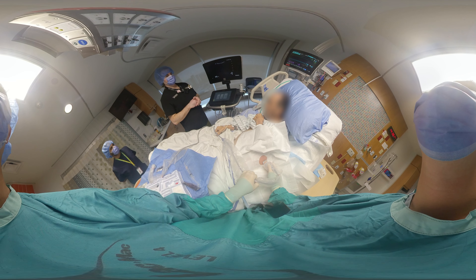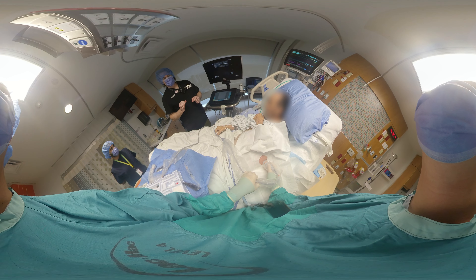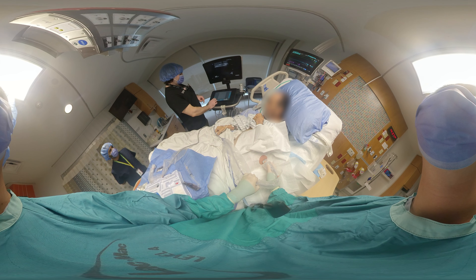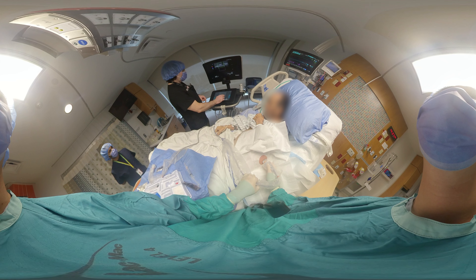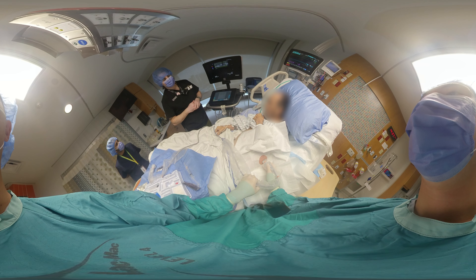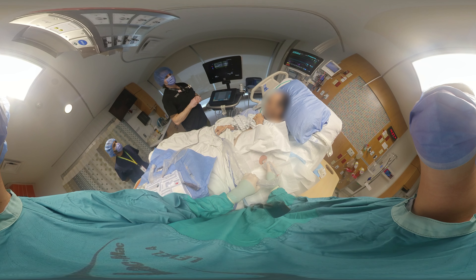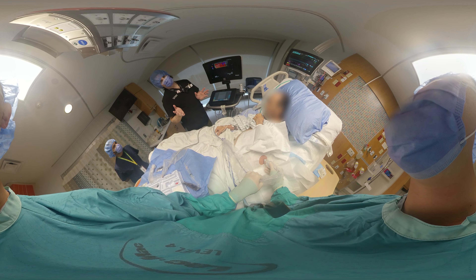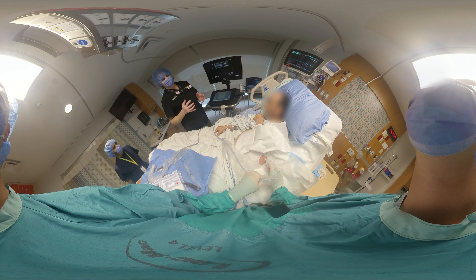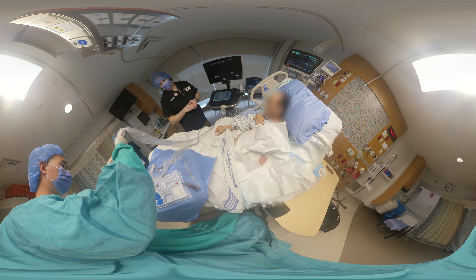Now we'll look at the abdominal wall. We're looking for circular anechoic densities between blood vessels. We can put some color Doppler over the abdominal wall, just looking for any low velocity signals or color signals that would indicate a vein. Do this in both short and long axis — move and rotate the probe just over your site. This helps identify whether or not there are vessels there. We don't see any vessels, so we're happy this is a safe site to enter.